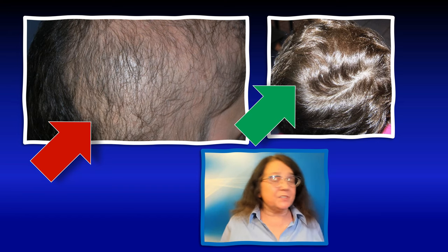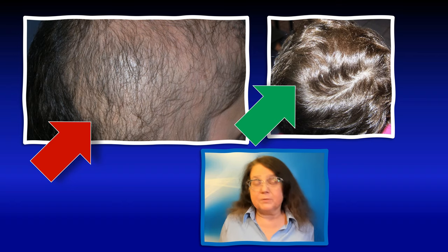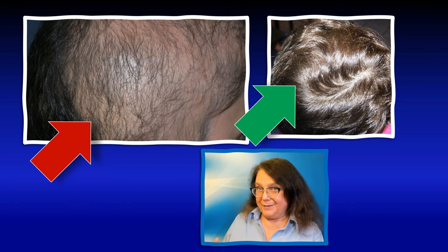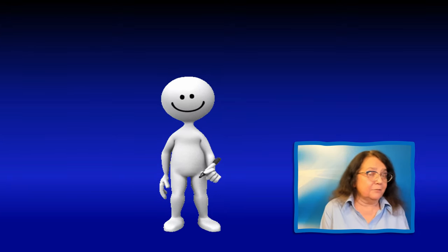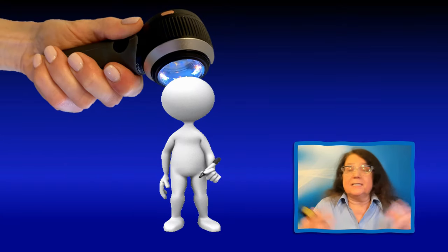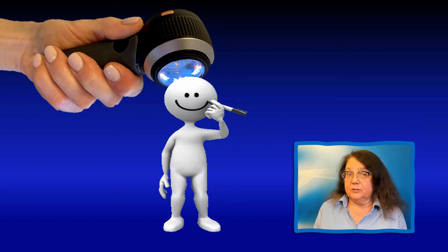So with trichoscopy, it is possible to identify different forms of trichotillomania, from very severe to very, very discreet. With trichoscopy, we identify hair loss which results from pulling or from mechanical force. We do not identify with trichoscopy the state of mind of the person or the psychological stress.